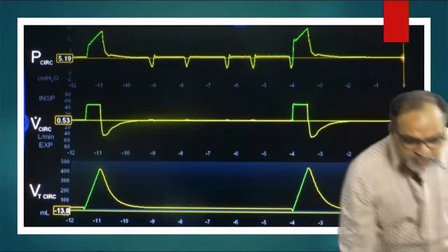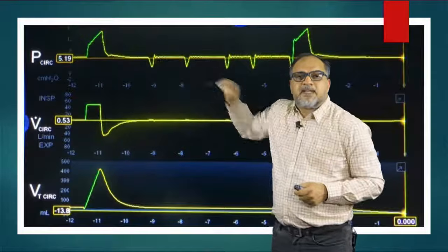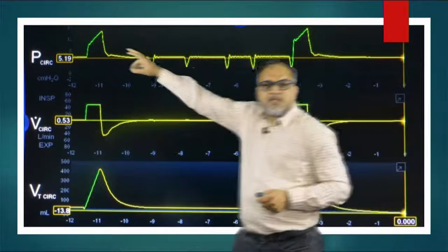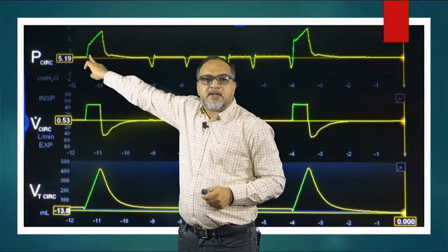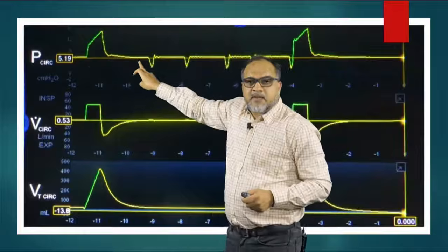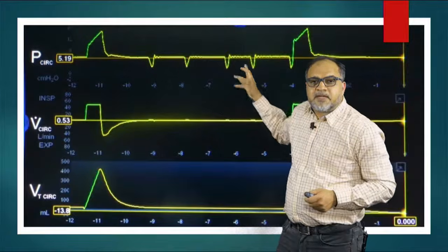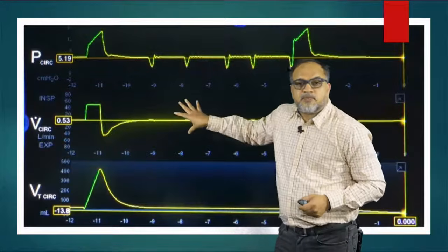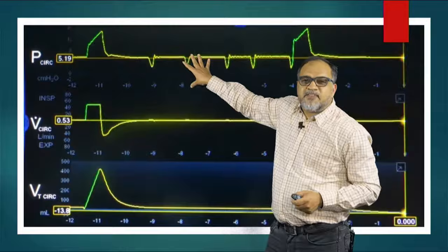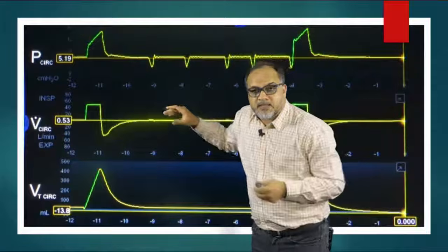This is the plain SIMV mode. Now this is a mandatory breath. It is not triggered by anything. It is a time triggered mandatory breath. Then in between the two breaths, these are the patient triggered breaths which were not supported. They did not generate any tidal volume. But the patient will feel dyspnea. The patient will feel that he is not able to breathe.